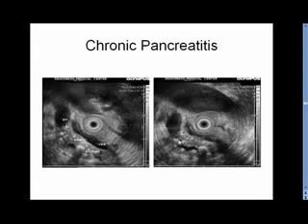Obviously this patient cannot be cured, but as you know, oftentimes treating these obstructing stones which lead to an upstream obstructive pancreatopathy may improve their pain. This patient was subjected to extracorporeal shockwave lithotripsy, which took care of the stone. The pieces had to be removed during ERCP, and the patient was doing better until fairly recently.